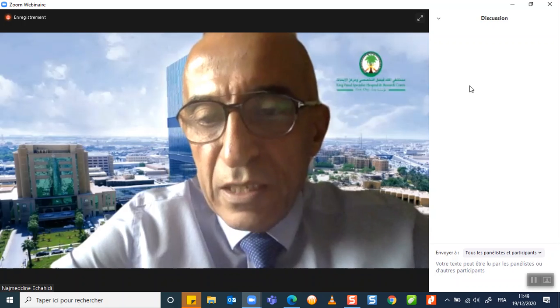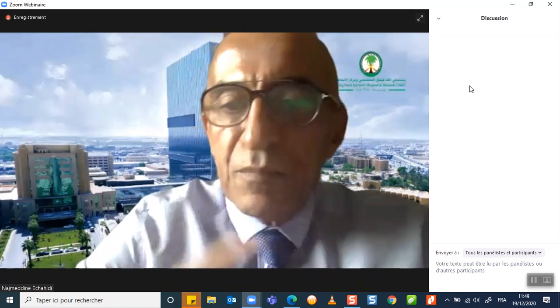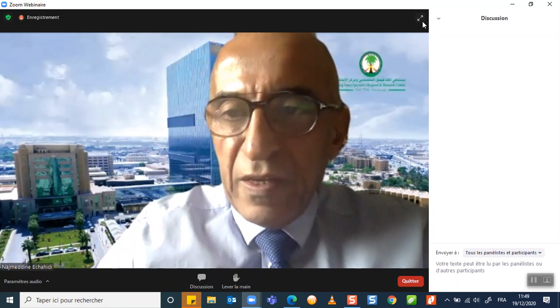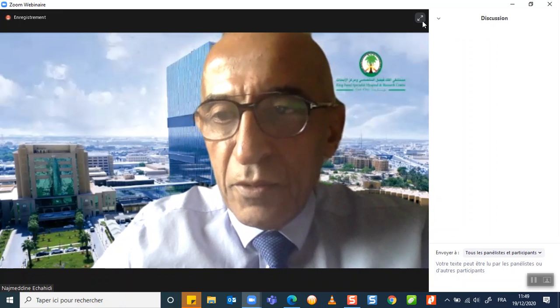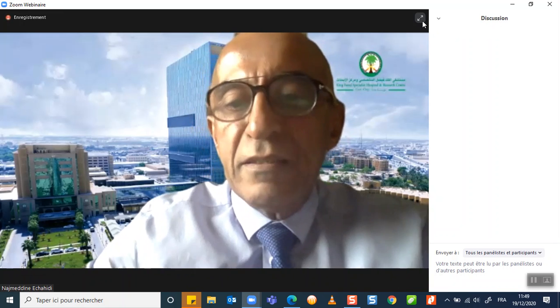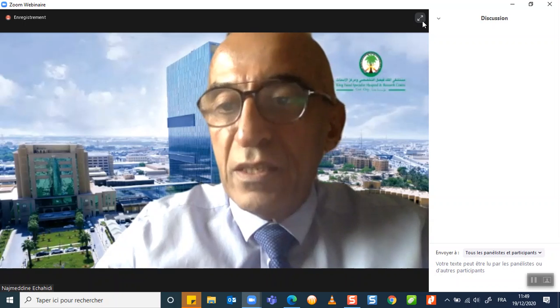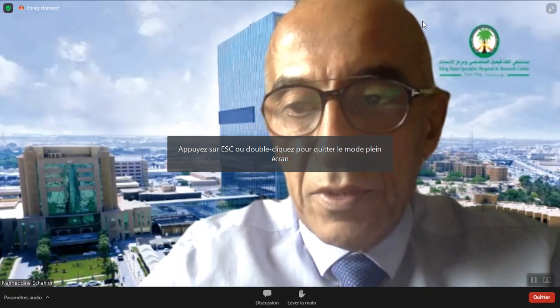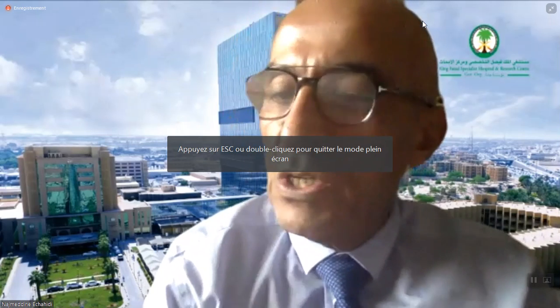I am trusting this algorithm more and more, because studies comparing data coming from device-based optimization and echo-guided optimization did not show any difference. Honestly, it did not show any difference.